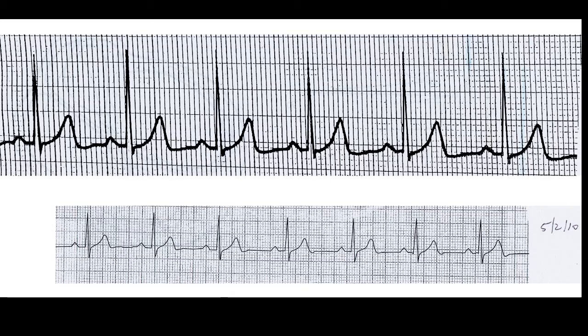If you look at the second beat over, that's pretty close to a thick line. You can start to count over to another thick line: 300, not 300, 150, not 150, 100, not 100, and then to 75, not 75, but the rate is somewhere between 75 and 100 as far as going by that technique.